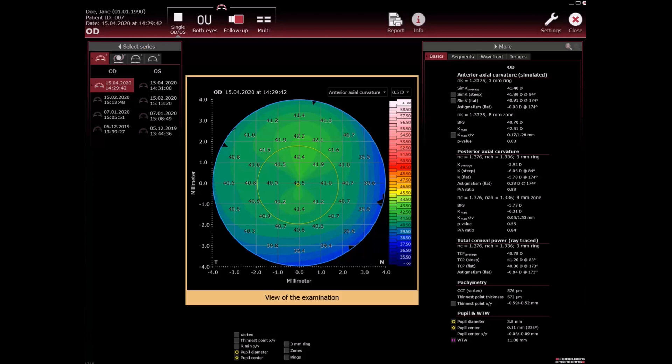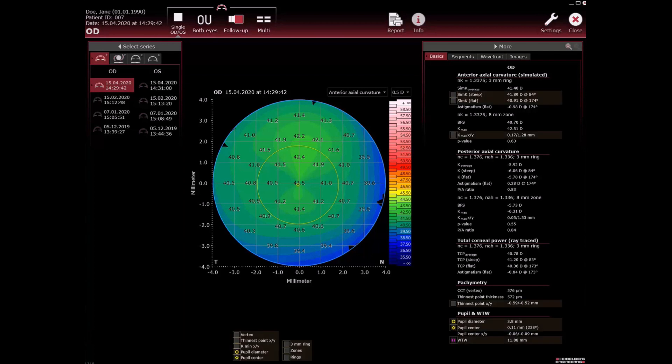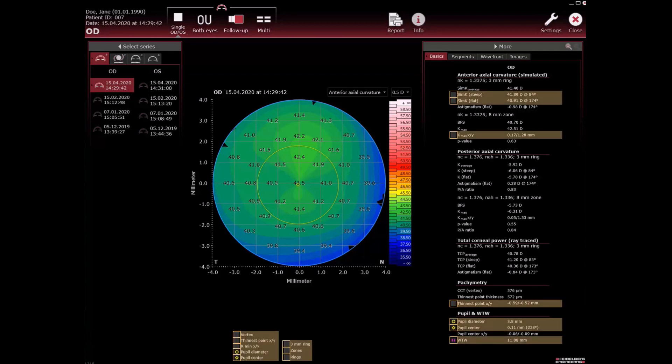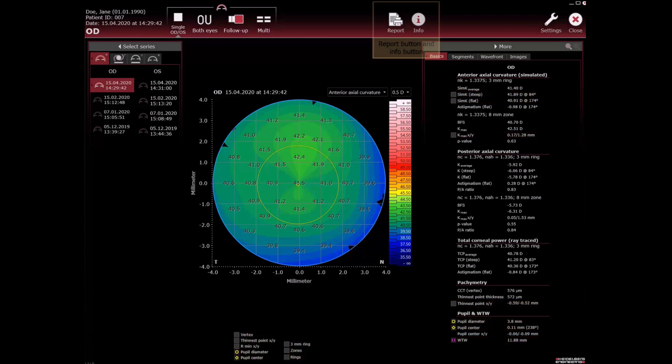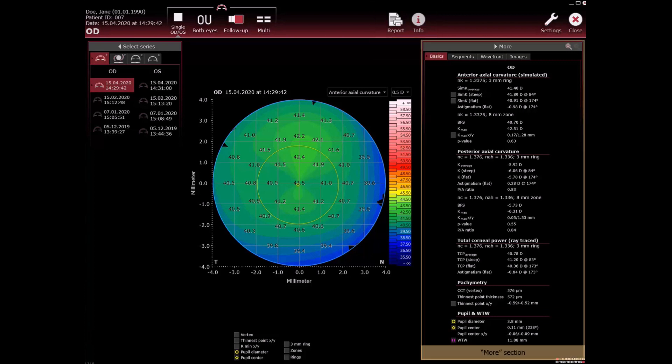View of the examination depending on the application. Overlay checkboxes and brightness and contrast slider if available for this view. Report button and the info button. More section where parameters and additional information of the chosen acquisition are shown.